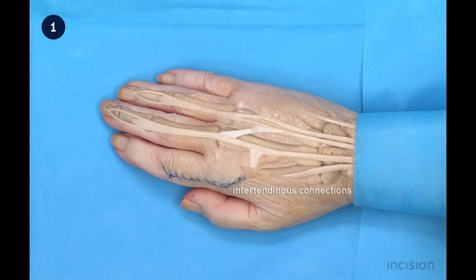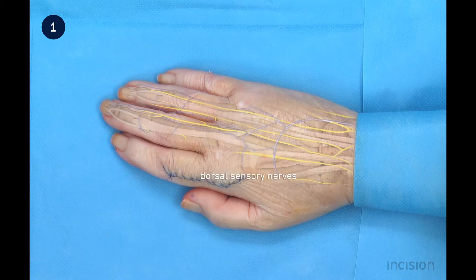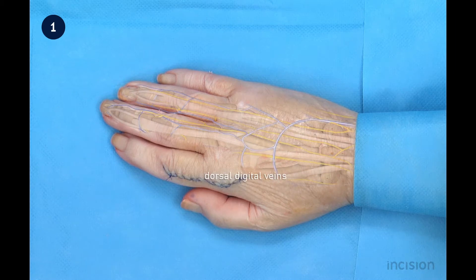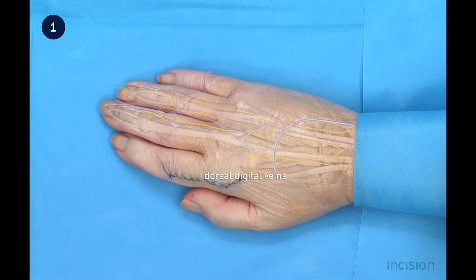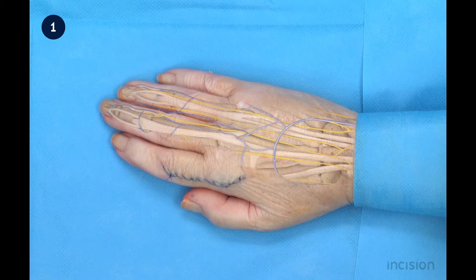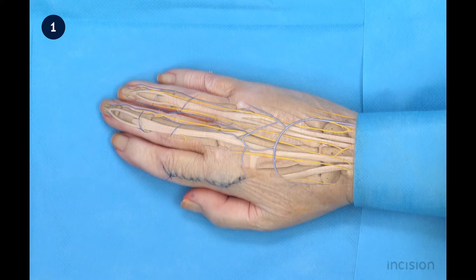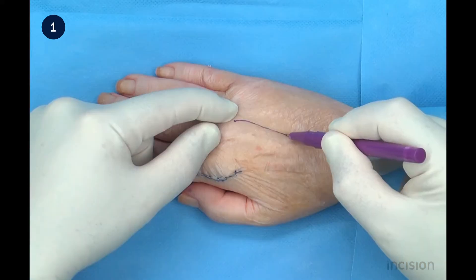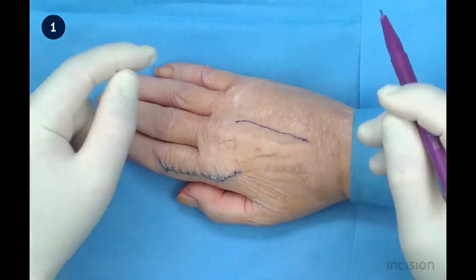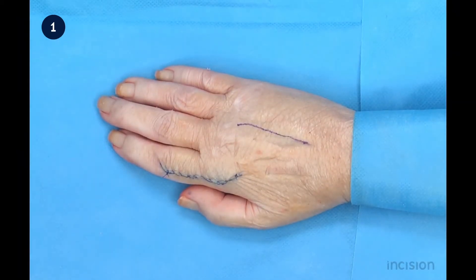Care should be taken not to damage the extensor tendons. The sensory nerve branches and the dorsal digital veins are susceptible to injury and should also be protected throughout the procedure. The skin is marked on the dorsal surface of the hand with a longitudinal line between the two targeted or fractured metacarpal bones — in this case, the third and fourth.